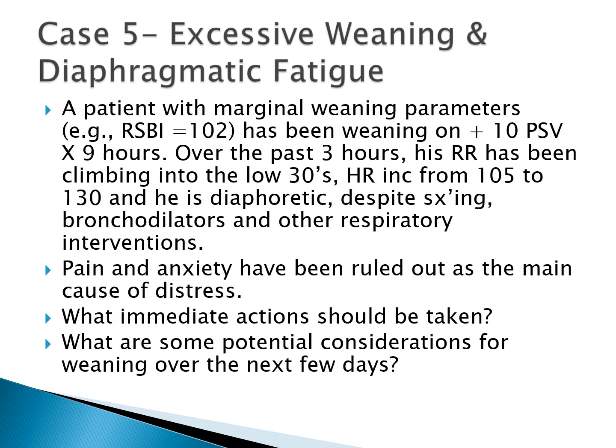This case is looking at a patient with marginal weaning parameters. RSBI is 102, weaning on 10 of pressure support for 9 hours. Over the past 3 hours, respiratory rate has been climbing. Now it's in the low 30s. Heart rate has been going up. The patient is diaphoretic despite suctioning, bronchodilators and other interventions, and pain and anxiety have been ruled out as the main cause of distress.